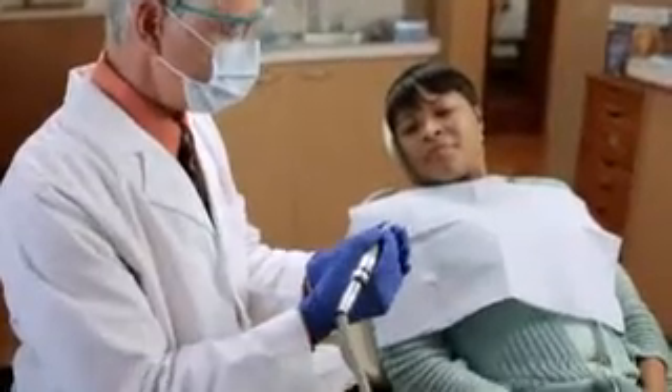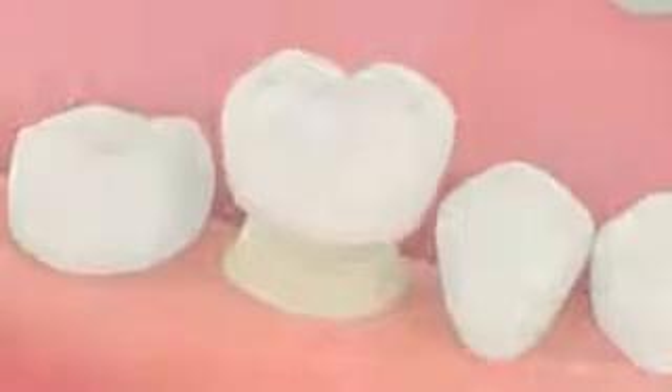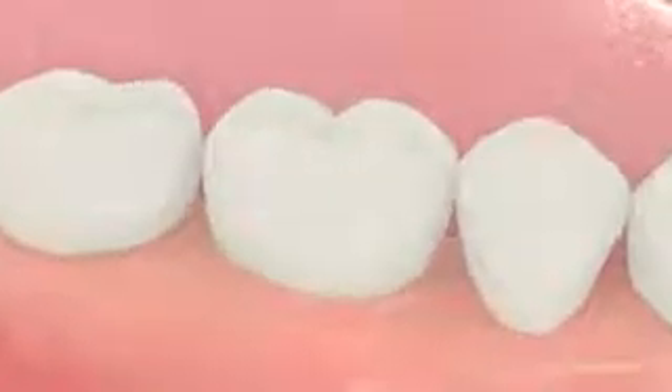This might take a few weeks, so before you leave the office, your dentist will attach a temporary crown to your tooth to protect it. At the next visit, your permanent crown will be cemented or bonded to your tooth.